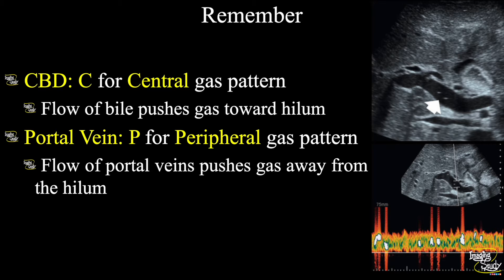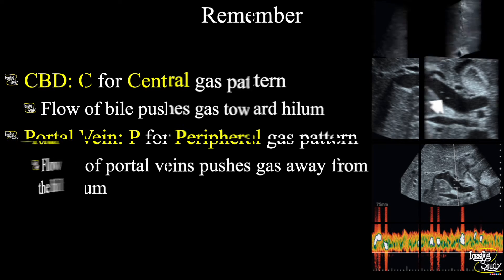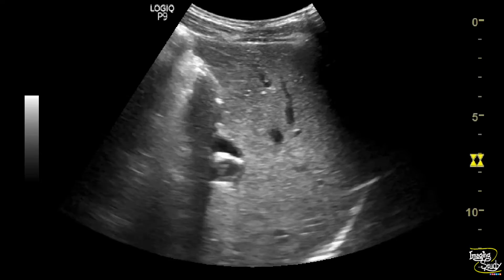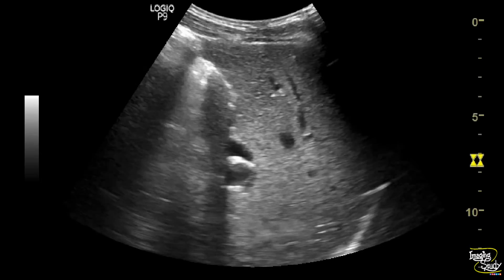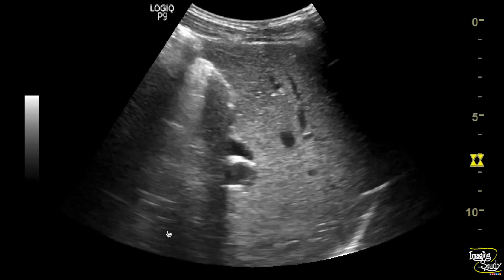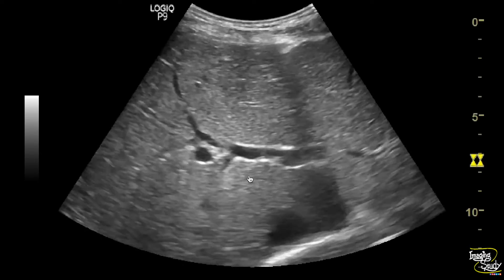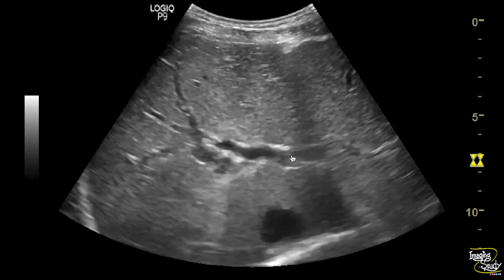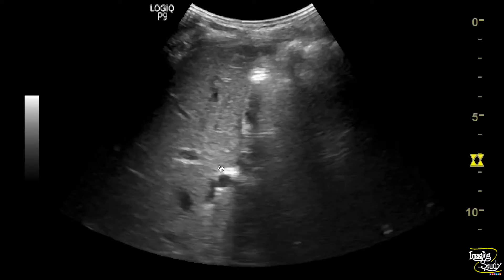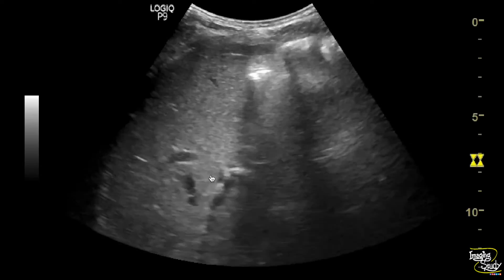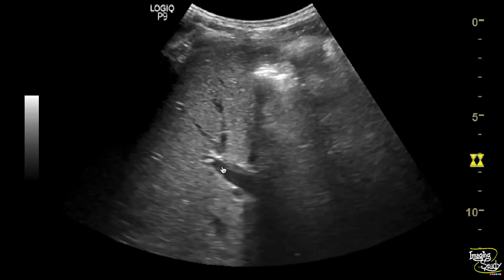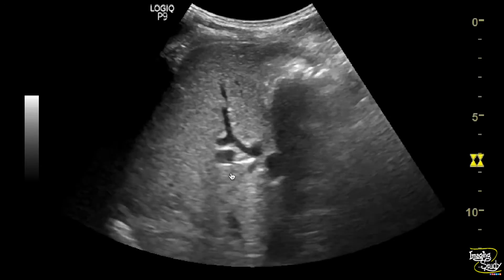Now let's see some cases. Here is a picture of the portal vein. You can see some echogenic mobile structures moving within the portal vein, moving towards the periphery. This is portal venous gas.